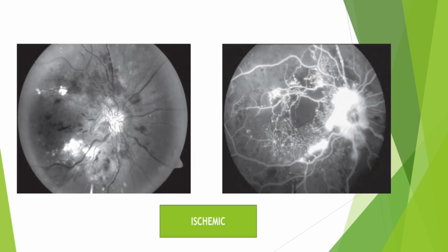Multiple hemorrhages. This is the FFA image showing a profuse disc leak, with the foveal avascular zone enlarged and irregular. The normal contour is not seen, suggesting macular ischemia.